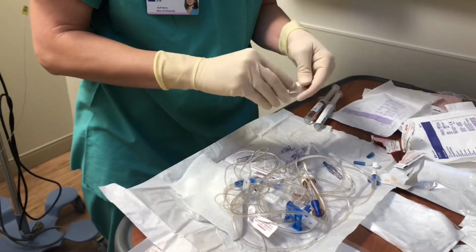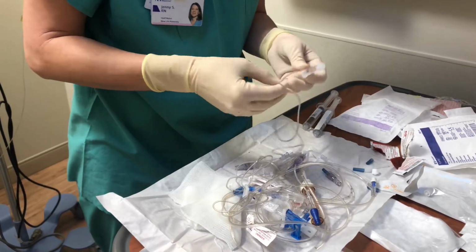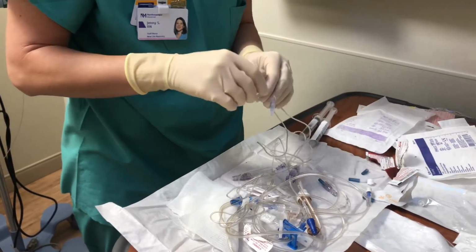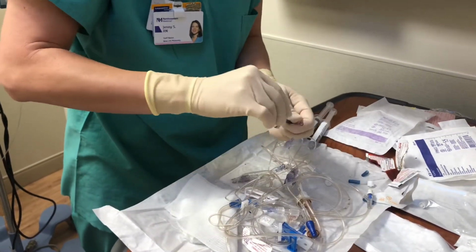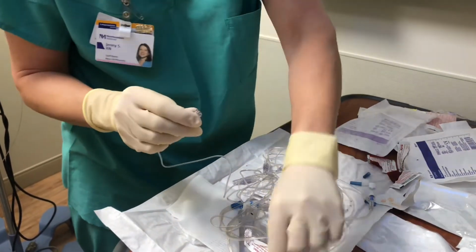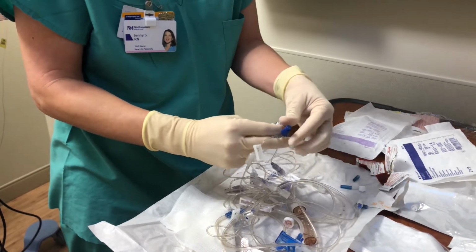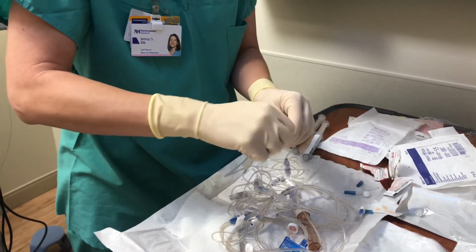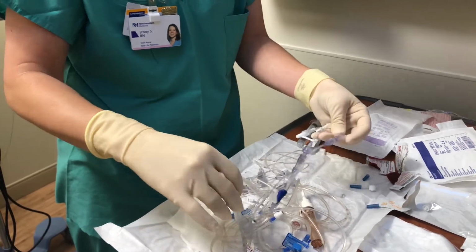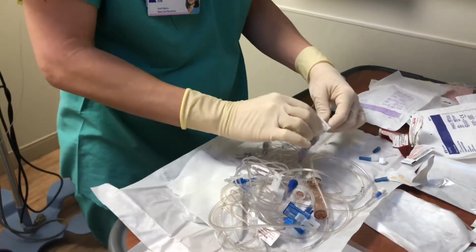Lastly, I'm going to do my inline medication tubing. And again, we want to leave these med lines in line for that 96 hours. So just like the IV fluid tubing, the med line is also going to stay in line for 96 hours. And then here, there's 2 options. You could attach another bifuse here if you wanted, but we have this clave right here, which is located below the filter. And so I like to put my med line right there, and it's coming off the TPN line, but it's below the filter, so we're okay with that. All right, so now we have everything closed there. I'm going to close my Y port slides.